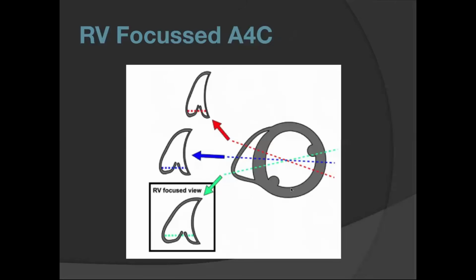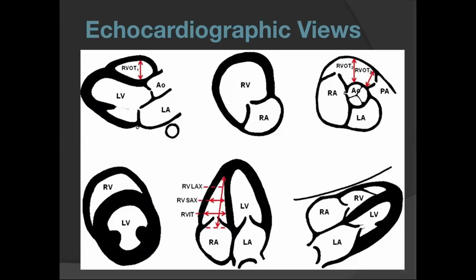An important concept which was brought out earlier again was Dr. Rahul, I'm just interrupting. Can you just go back to that subcostal view? I think this is a good view to measure the RV free wall thickness. Very importantly, RV free wall thickness is measured in the subcostal view. The recommended view is this, at the level of the opened tricuspid leaflet when it opens in diastole.